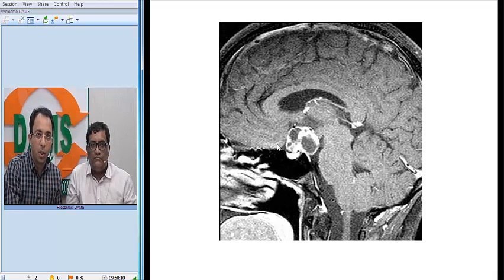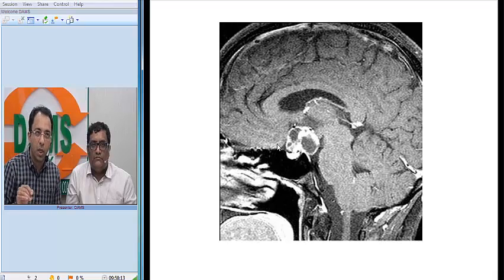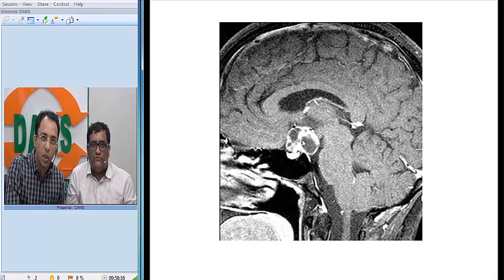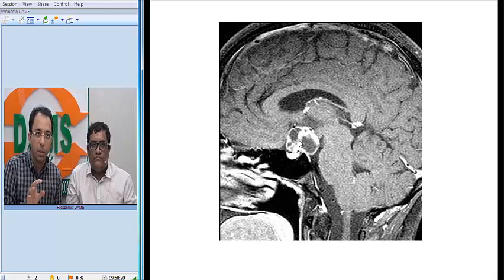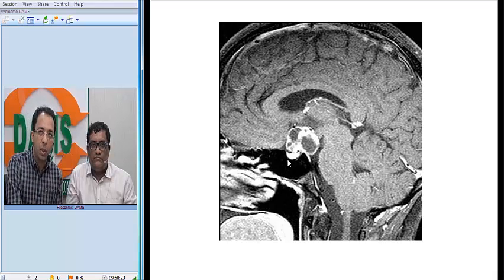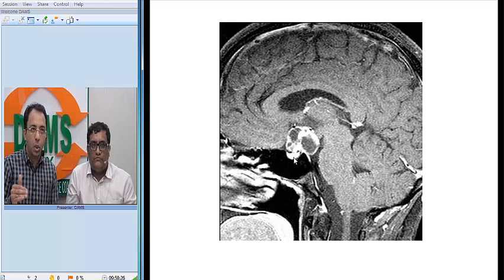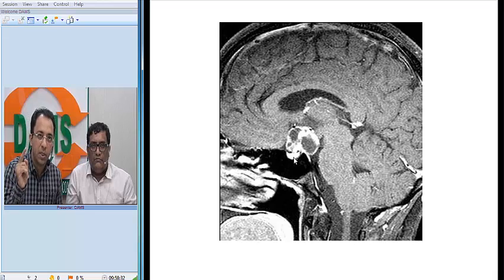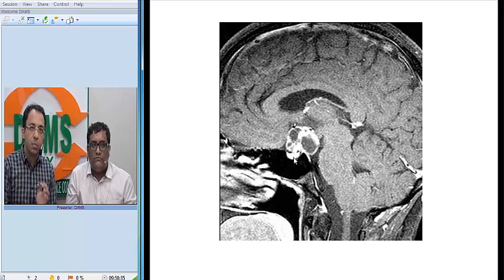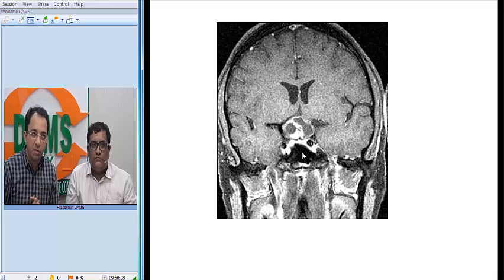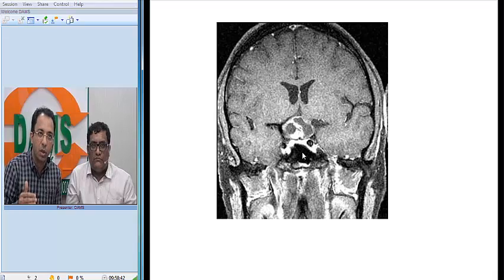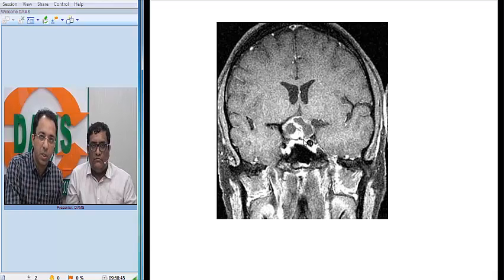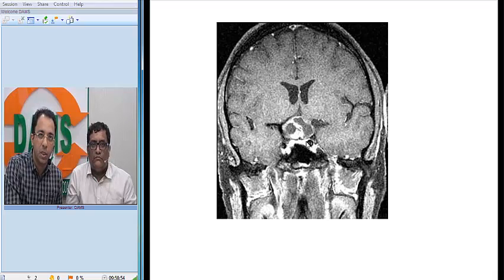To be sure, I want to see a contrast-enhanced image. On the post-contrast image, the solid areas are enhancing. So this tumour has a solid-cystic appearance in the suprasellar cistern, and you can identify the pituitary separately. It is not of pituitary origin — it is of suprasellar origin with both solid and cystic components. On coronal T1-weighted contrast-enhanced section, the tumour is clearly separate from the pituitary, with visible cystic and solid components.